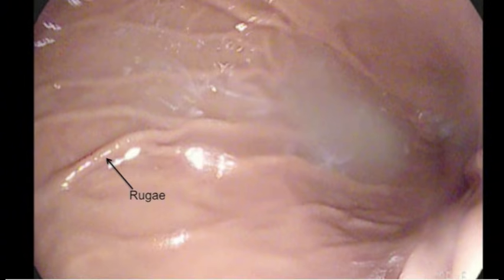After passing through the lower esophageal sphincter, a clear view of the gastric morphology can be seen. Upon gross observation, a thin film of mucus covers the gastric mucosa to protect the underlying tissue from the high hydrochloric acid content. Gastric folds called rugae are also seen, which disappear upon distension of the stomach.